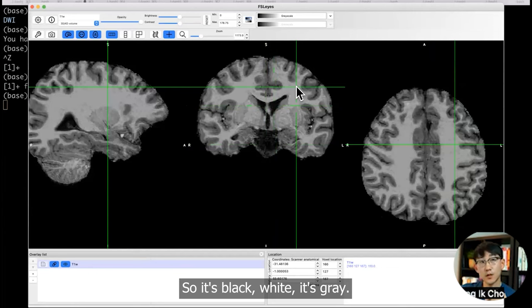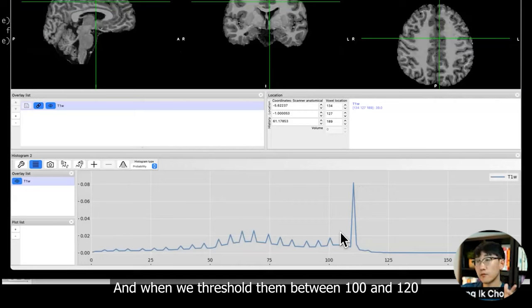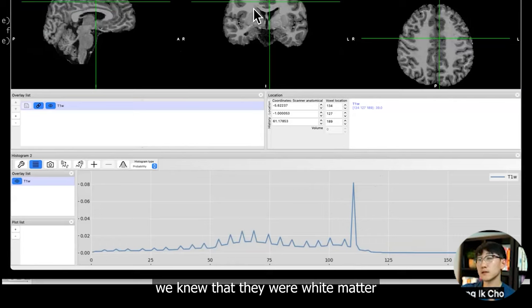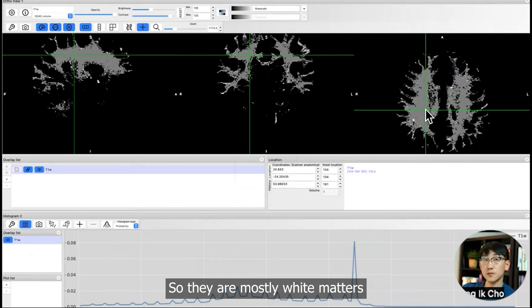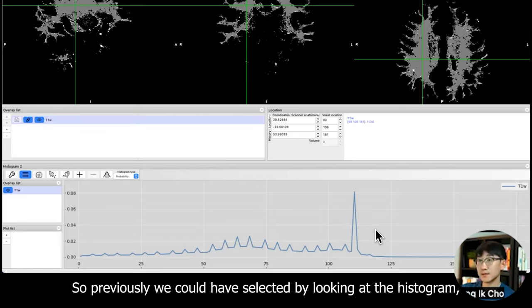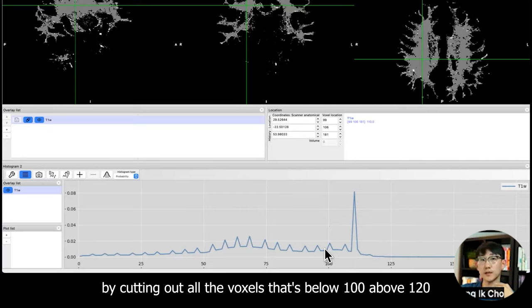We would like to differentiate gray matter, white matter, and CSF. One way that we can do that simply is just to threshold them by how bright they are. From the histogram, when we thresholded them between 100 and 120, we knew that they were white matter. So previously we could have selected by looking at the histogram to give me the white matter area by cutting out all the voxels that are below 100 and above 120.